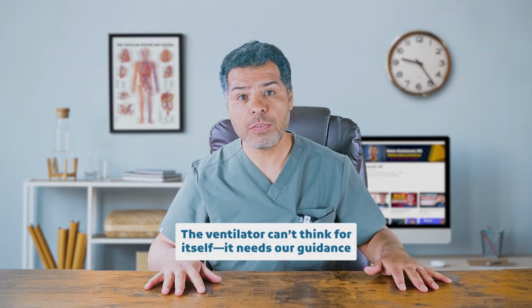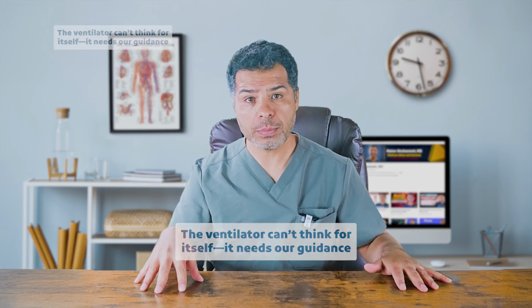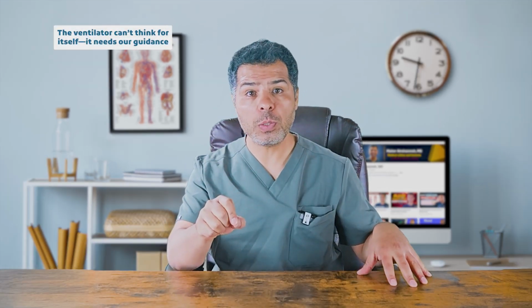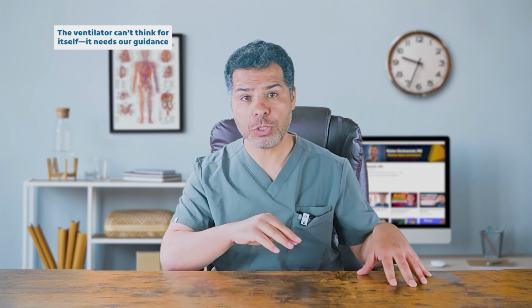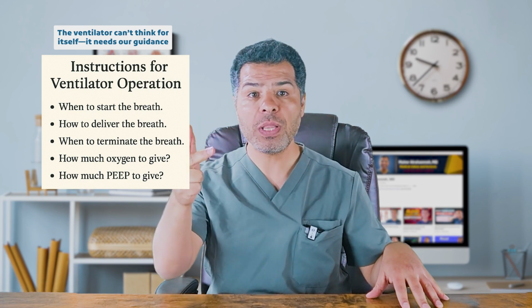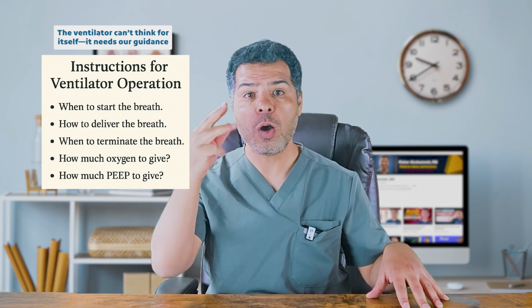Let's move to the sixth concept. The ventilator cannot think for itself. It needs our guidance. So please give me your full attention here. For the ventilator to function properly, we have to give it 5 instructions. The first one, when to start the breath, then how to deliver the breath, when to terminate the breath, how much oxygen to give, and how much PEEP to give.